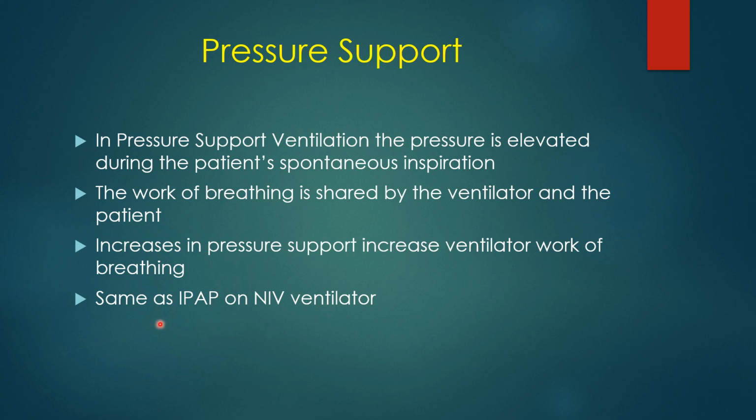And I know you've heard about and seen and played with our BiPAP machines, NIV ventilators, like the V60 is a common one we're using today. There's also one called the Trilogy, and there's some other ones. But pressure support is the same thing as the IPAP on our non-invasive ventilators. So you've already had some experience with pressure support. It was just called IPAP.